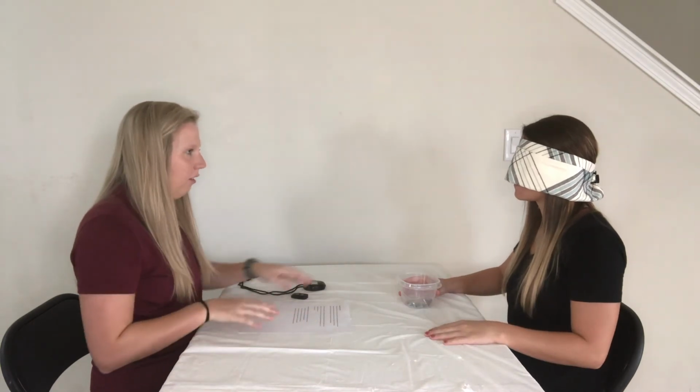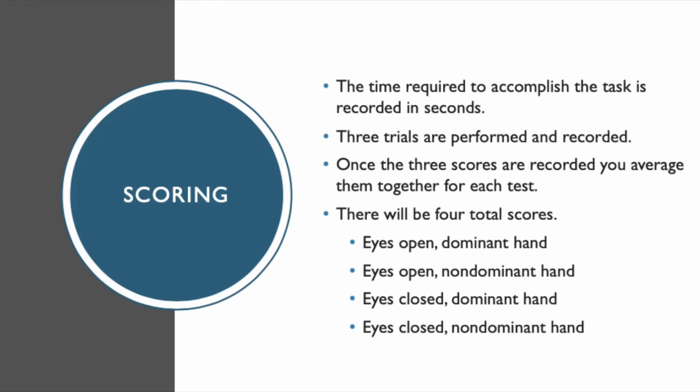Good job. All right. Thank you very much. The time required to accomplish the task is recorded in seconds. 3 trials are performed and recorded. Once the 3 scores are recorded, you average them together for each test. There will be 4 total scores.